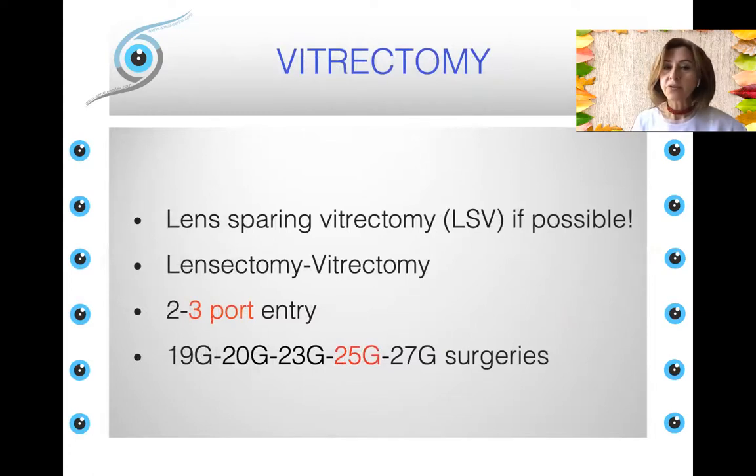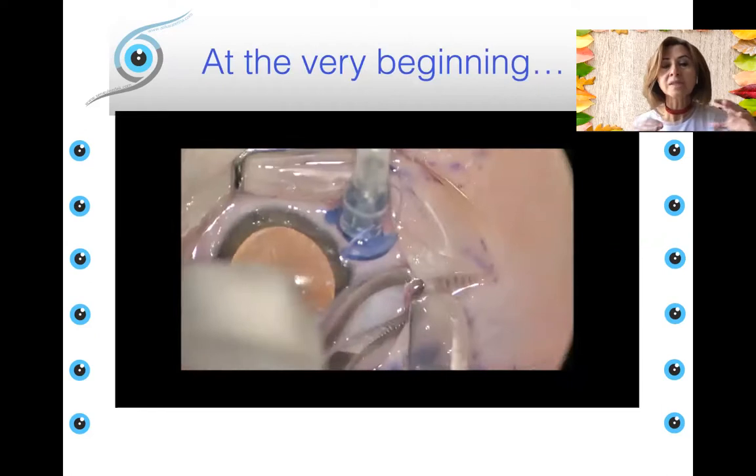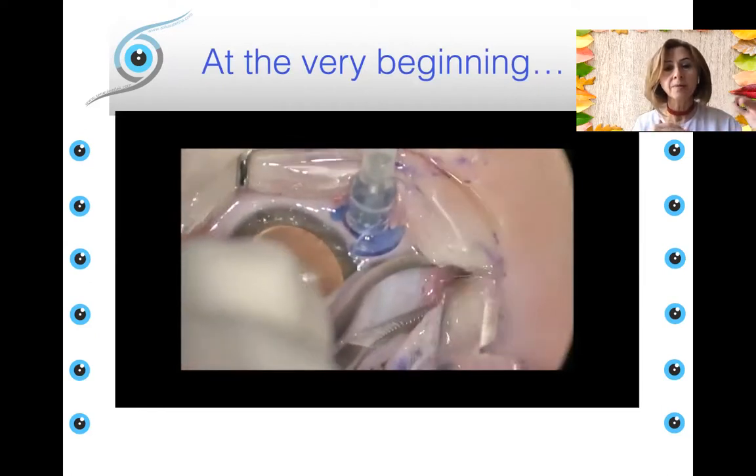In vitrectomy, we always try to do lens-sparing vitrectomy if possible. But if not, lensectomy-vitrectomy may be an option. You can do 2-port, 3-port entry or any gauge, but my personal choice is 3-port vitrectomy with 25 gauge. At the very beginning, the space is very narrow; the interpalpebral rim is very narrow.